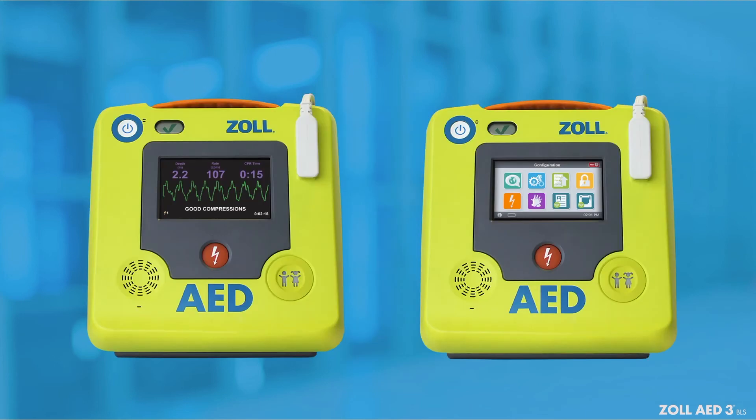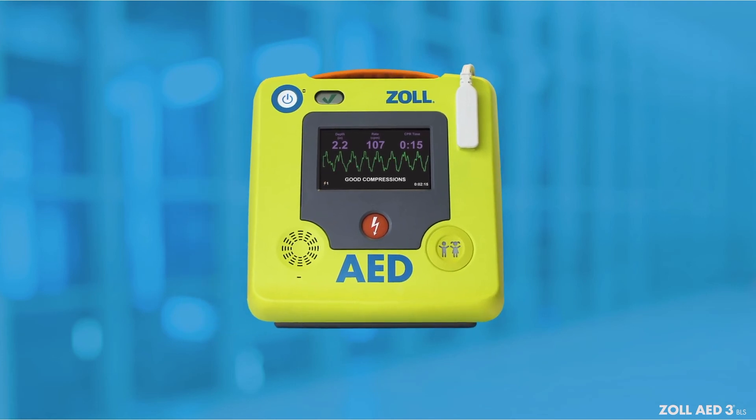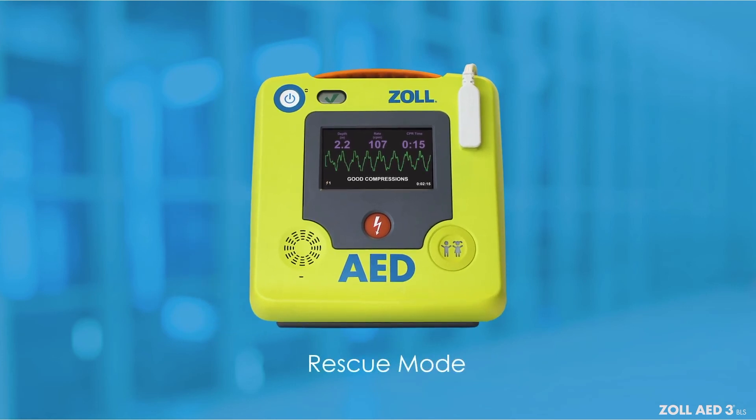The Zoll AED-3BLS has two modes of operation: rescue mode and AED management non-rescue mode. In rescue mode, the LCD screen displays graphics that are coordinated with audio prompts to guide you through a rescue.